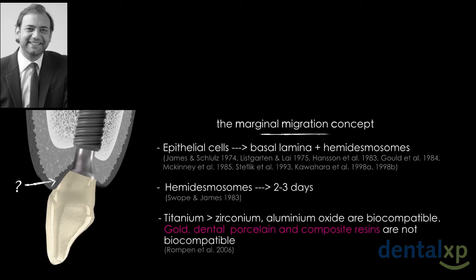Another study by a good friend, it's a review actually, not a study, by Rompen, showed that plastic and acrylic is not a biocompatible material. So it will not really enhance this adherence of epithelial cells. Some people now, and there are also 1 or 2 articles, say that very highly polished composite can have an adherence.